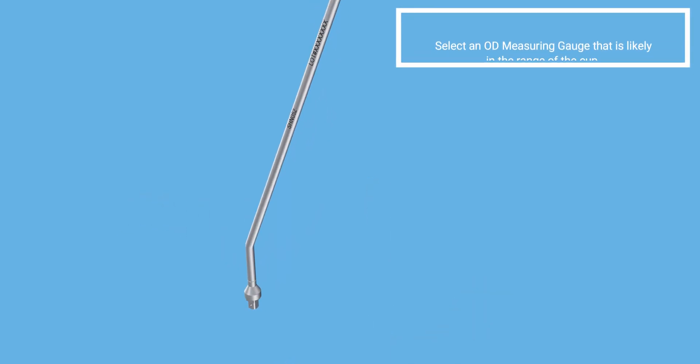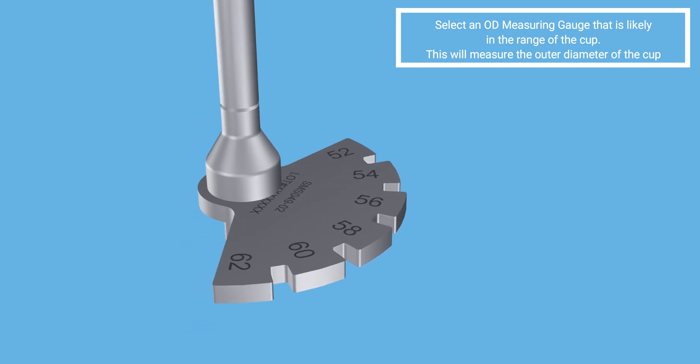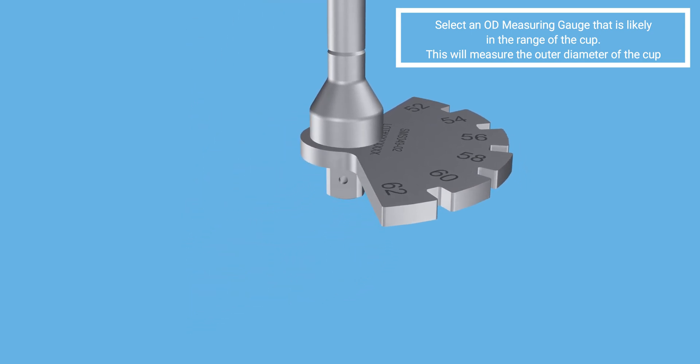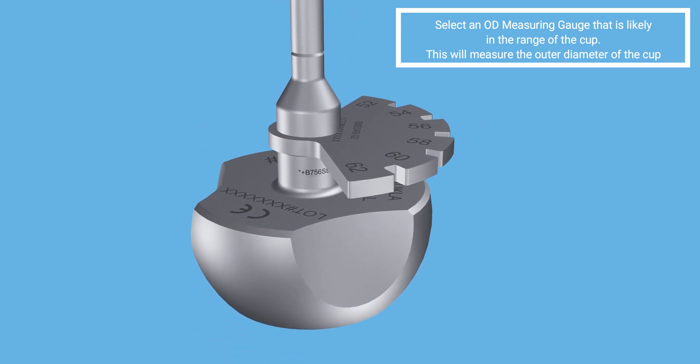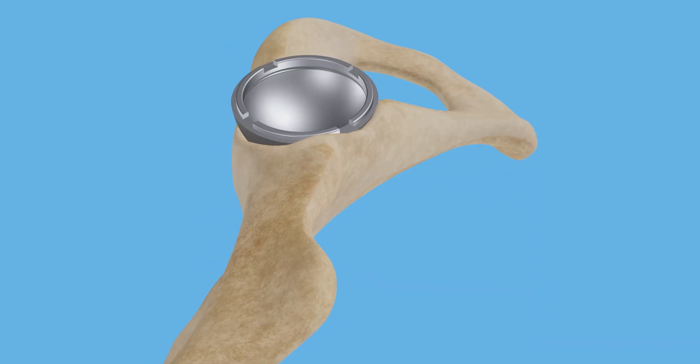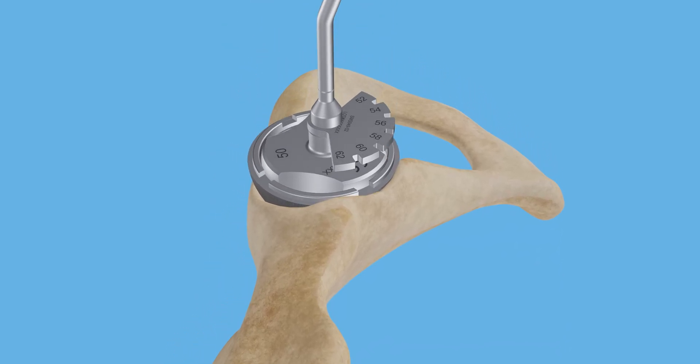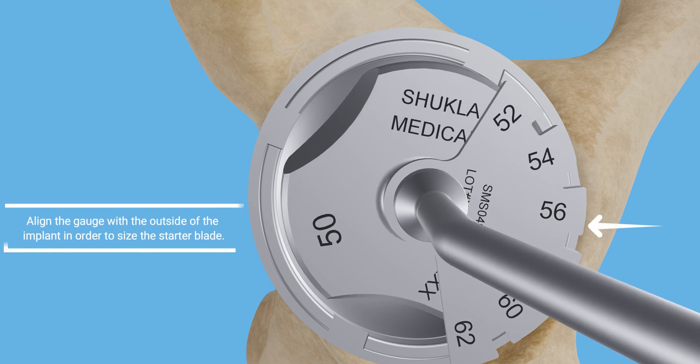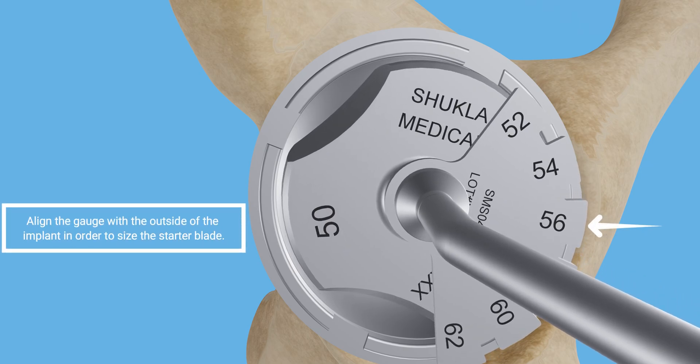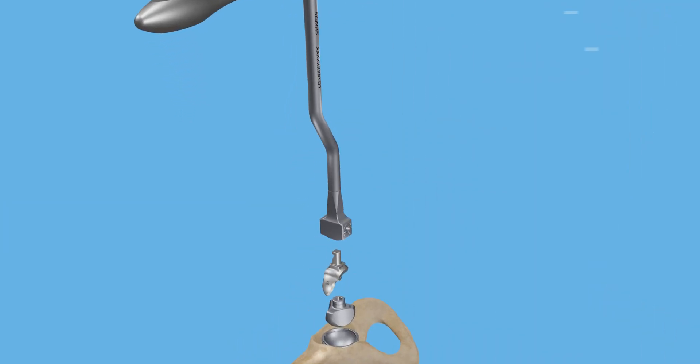For accurate sizing of the starter and finisher blades, assemble OD gauge handle with the OD measuring gauge and centering ball or bob. Align the OD measuring gauge parallel to the cup surface. Find the number on the gauge that correctly matches the outer diameter of the cup to choose the correct starter and finisher blade size. Disassemble the previous assembly.